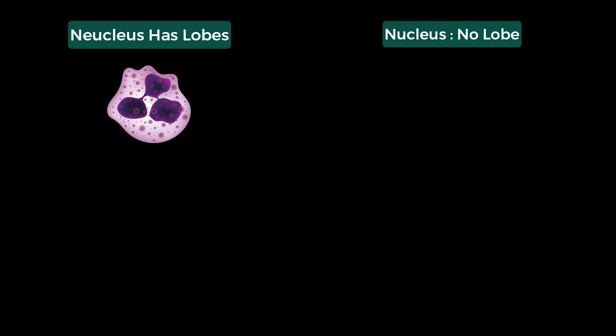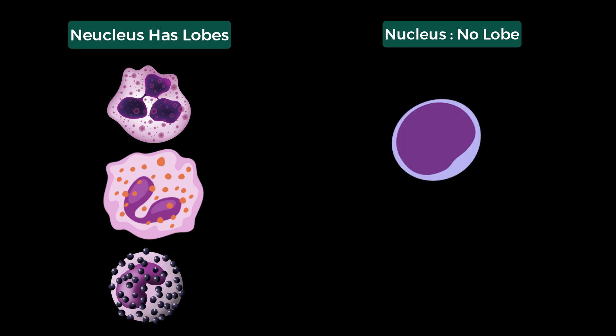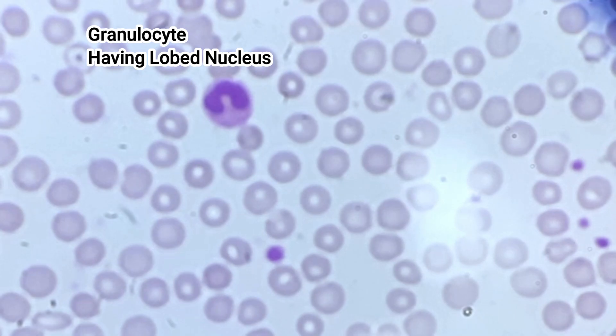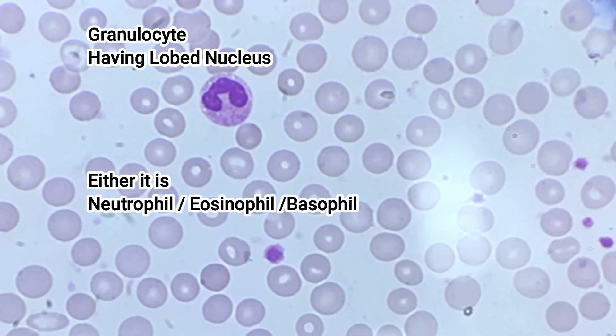Notice if the nucleus has lobes or not. If it has lobes, it may be a neutrophil, eosinophil, or basophil. If the nucleus has no lobes, start thinking it might be a lymphocyte or monocyte. Now, coming to the granulocytes which have lobed nuclei, we will limit our thinking to neutrophil, eosinophil, or basophil only.